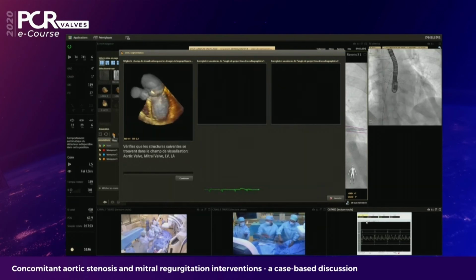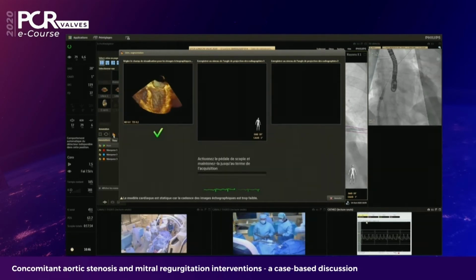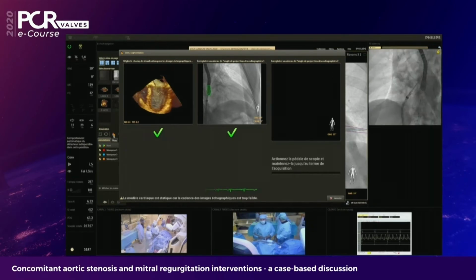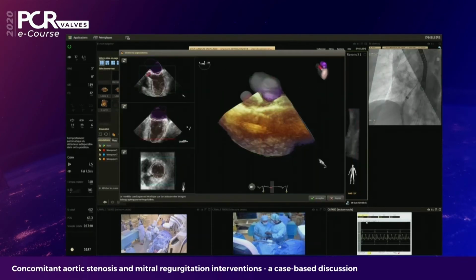Another very interesting tool we have on the Echo Navigator is the Global Heart Fusion. So we do some acquisitions. The first acquisition is coming from 3D. The second is an X-ray acquisition. We change the flex arm position to an opposite position in order to have 2 dimensions in the X-ray acquisitions. Okay. The system is modeling the heart, and you see that there are some forms, some models in the echo which represent the personalized modelized heart. It's quite okay here, so we can accept this model.